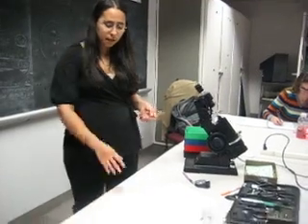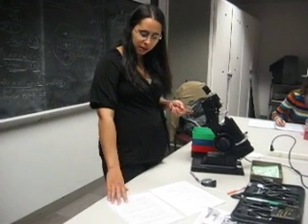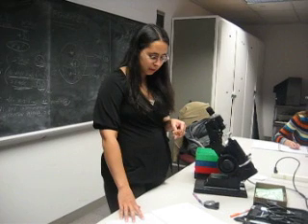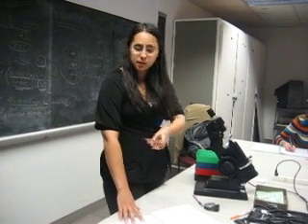Going on to number 4, it says using the RX from station 3, determine the percentage of the intermediate portion of the lens and specify the size of the trifocal. Kyle, can you grab me a flat top trifocal, not this one? Thank you.